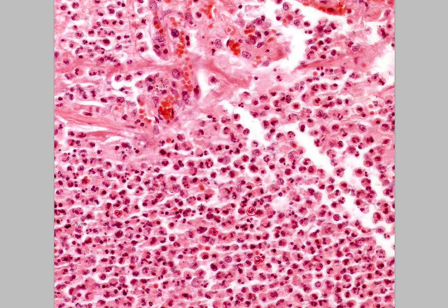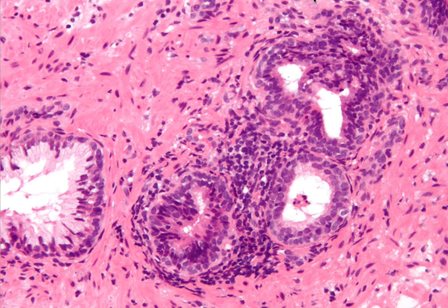The inflammatory cells infiltrated the alveolar spaces, and we see some alveolar macrophages, some bleeding, and some other exciting things. So how about this sample? Is it acute or chronic inflammation?